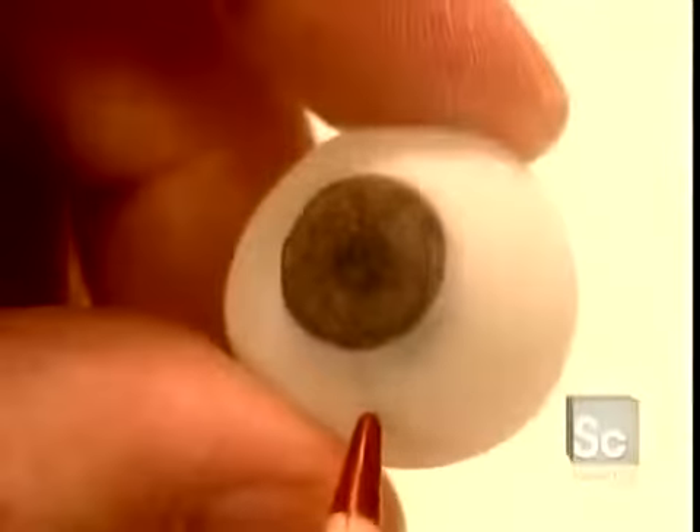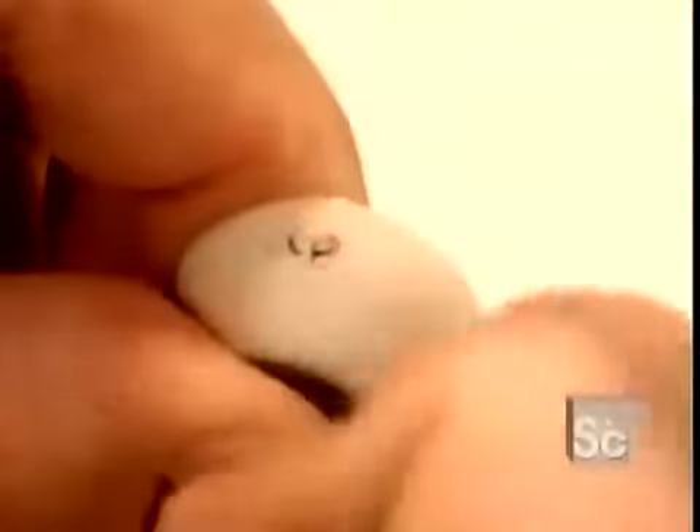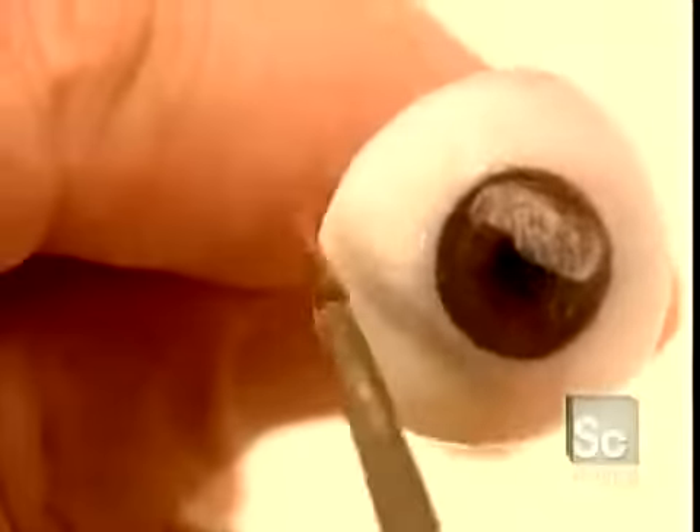Then, using hard coloring pencils, they add finishing touches to the iris and draw blood vessels. They label the eye with the patient's initials and then apply an acrylic coating to seal the pencil marks.